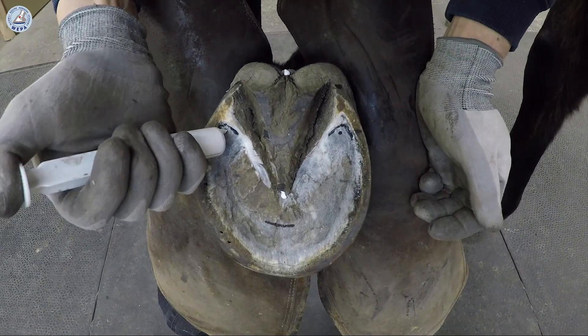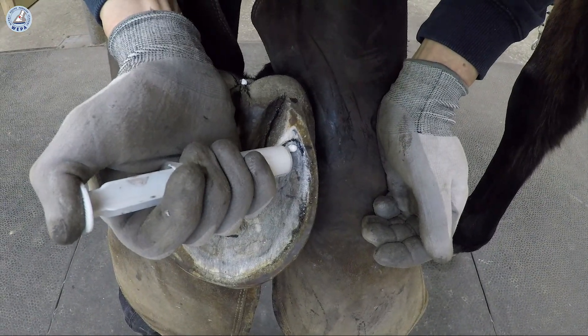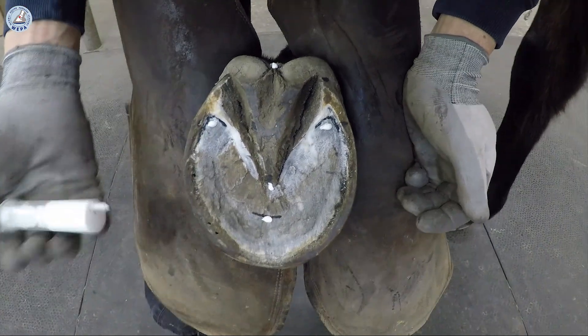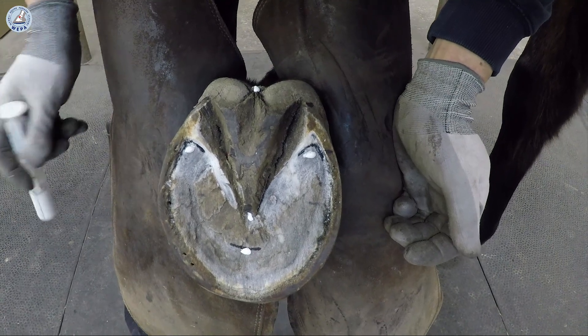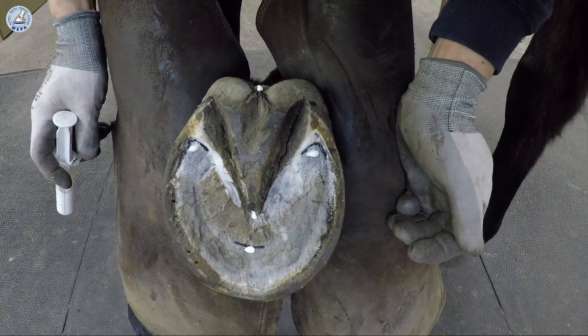We mark the end of the coffin bone and the apex of the coffin bone. We always use these five markers to make the x-rays.